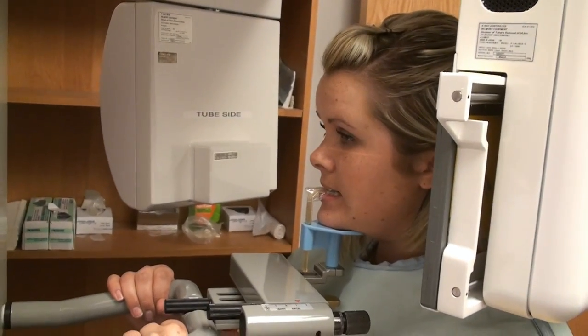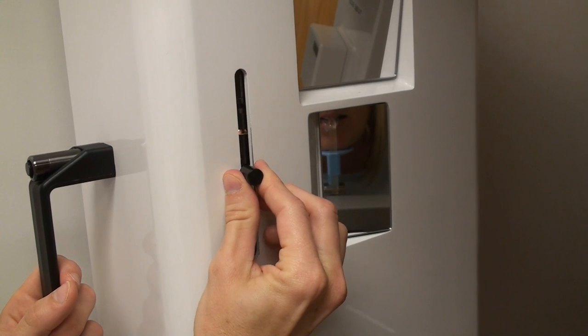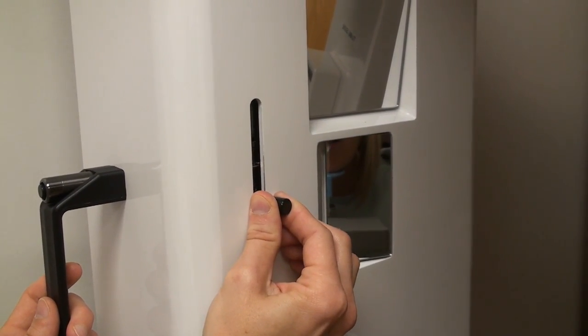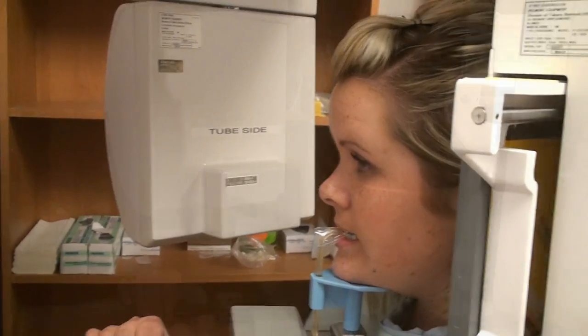This is the notch — the little button that does the Frankfurt plane. You can move it back and forth and up and down, so move it so you can see the light all the way across her face. I like to turn off the lights so I can see those lights better. Position it first right on the bottom of her infraorbital notch, and have it come to the middle of her ear opening or the tragus. We were a little bit high, so bring the machine down and have the patient tuck her chin slightly. Now we've got it on the bottom of her infraorbital notch and straight through the middle of the ear opening.